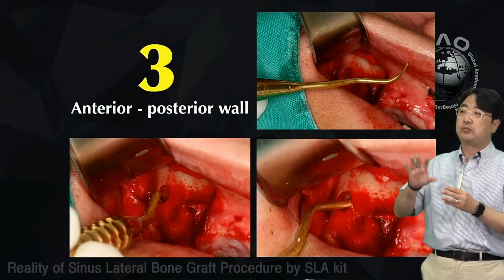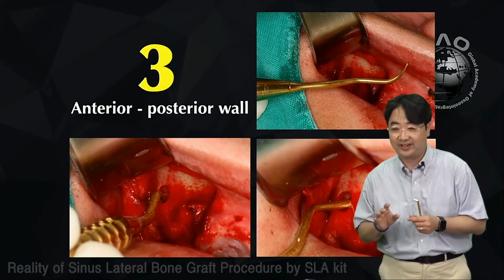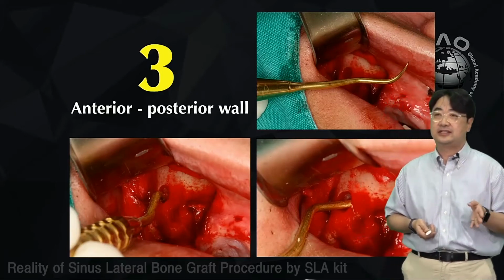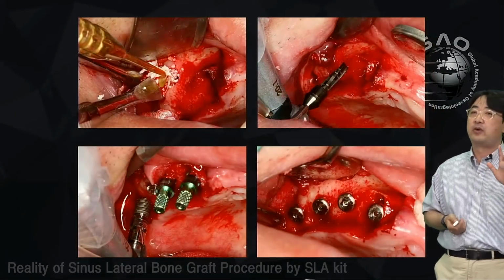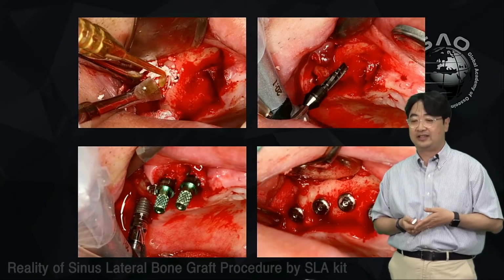So it's double twisted, like a twice twisted flare. So you do it like this. Then after that, you do the bone graft first before you place the implant. Then you can place the implant.